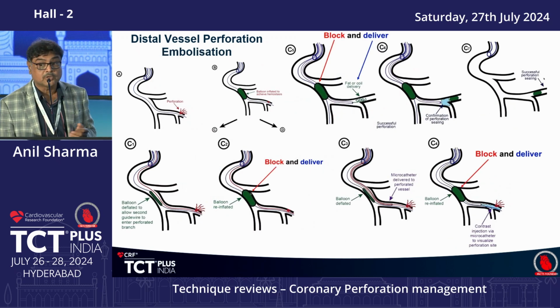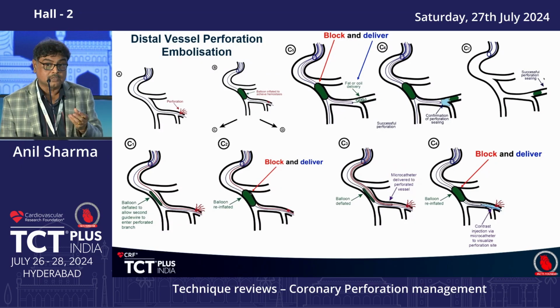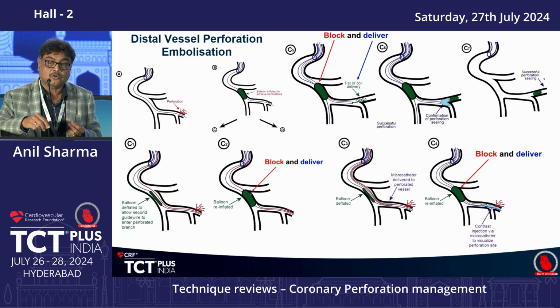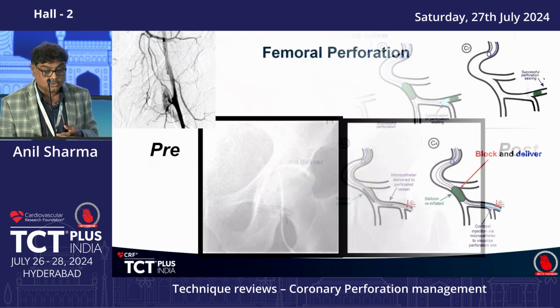As we discussed about the aorta also, the covered stent can close the artery. Here it is the coils you can put, but again make sure that coil is proper. Coil is costly, so you can use some clot also, you can use the fat also, but dissolve that fat or clot into the dye so we can visualize. Otherwise it is very difficult, they are beyond your control.